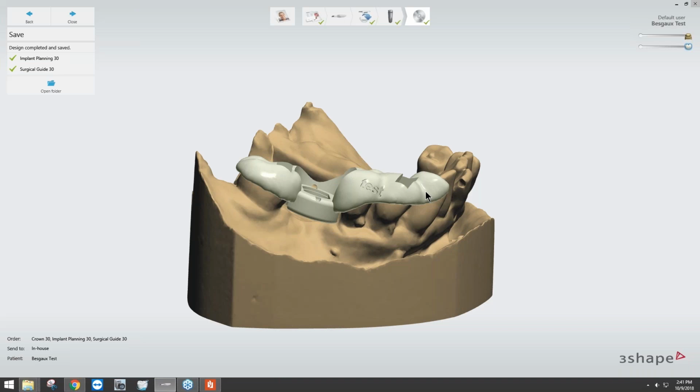Right now, I don't have the pricing for the Implant Studio software. You'd want to reach out to your Henry Schein rep to get a quote.